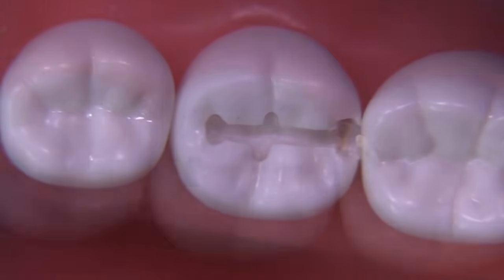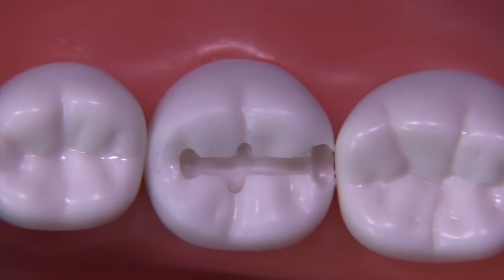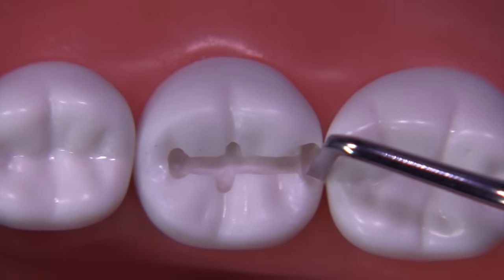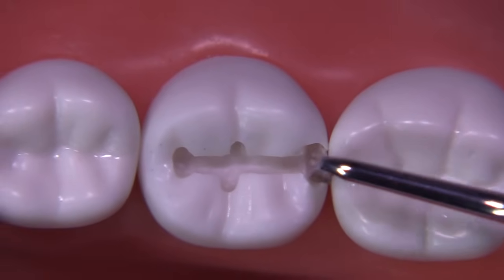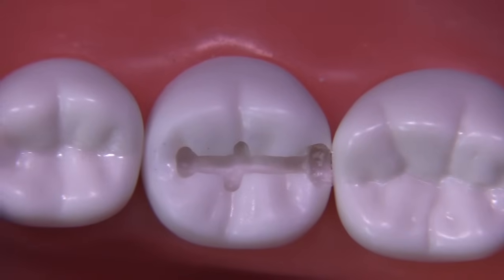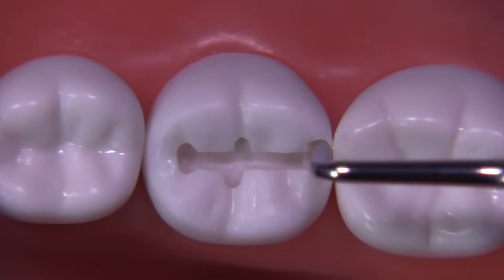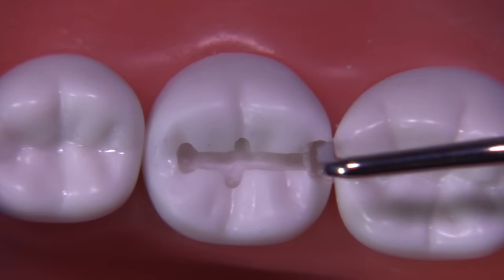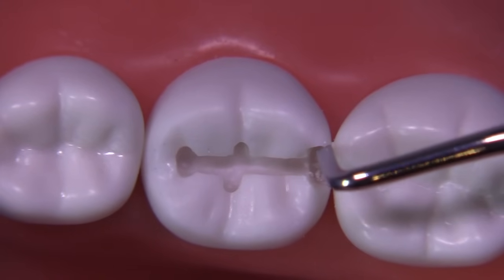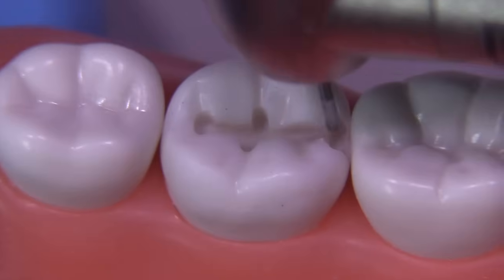We're ready to move on to extending the box. You can see we've broken through the gingival just a little bit, and we have these undermined areas on the facial and the lingual which are going to need to be chopped away. Without putting the burr in there, I'm going to use the hand instrument and push down with a little bit of force at the proper exit angle — maintaining that 90-degree exit angle towards the gingival. One thing to watch out for is that the instrument can scrape against the adjacent tooth, so go a little deeper axially with your burr before placing the hand instrument.